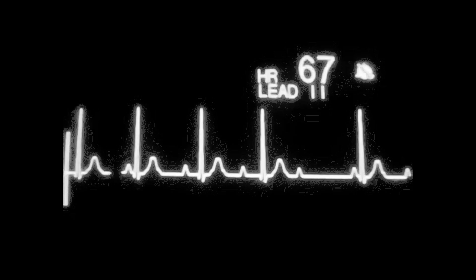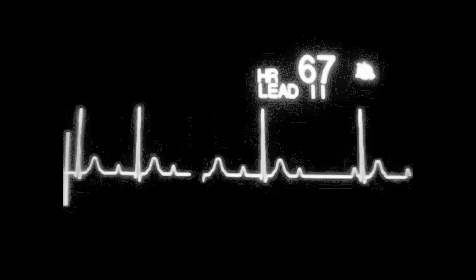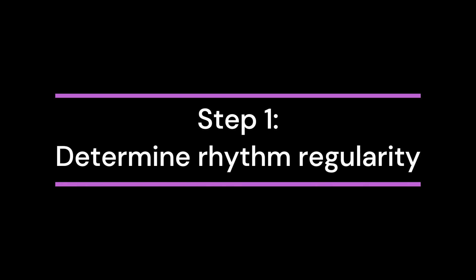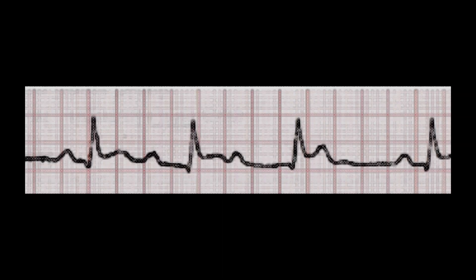To better understand this, let's take a look at a sample EKG reading by performing the steps of EKG analysis. Step 1: Determine the regularity of the rhythm. The atrial rhythm will be regular since there's nothing wrong with the atrial conduction system. The ventricular rhythm, however, will be irregular as seen in this EKG strip, with the R-to-R intervals having inconsistent lengths.